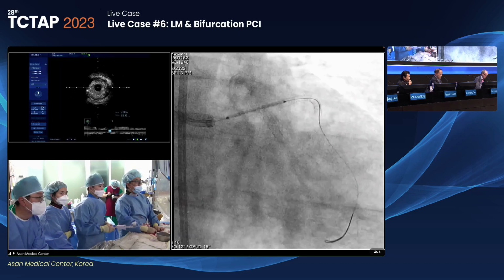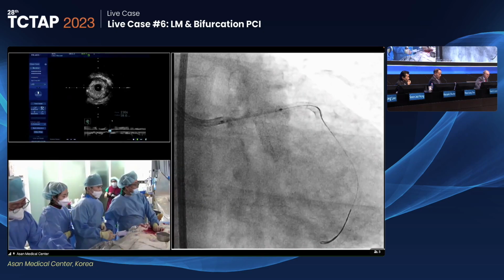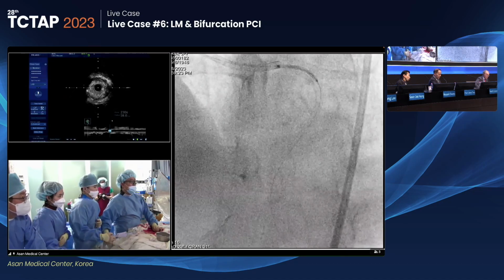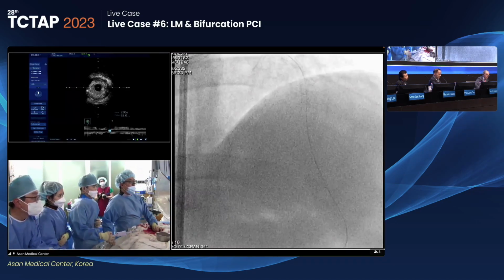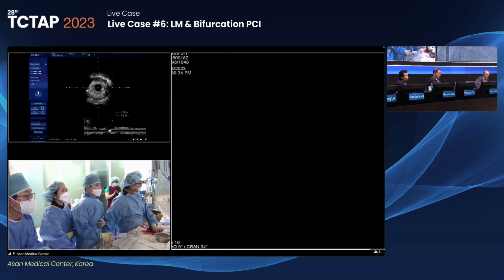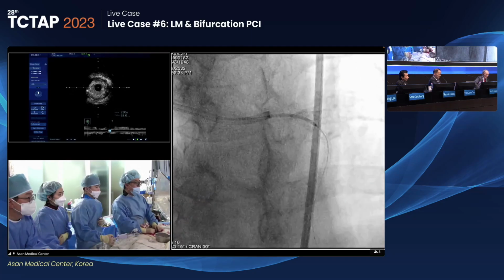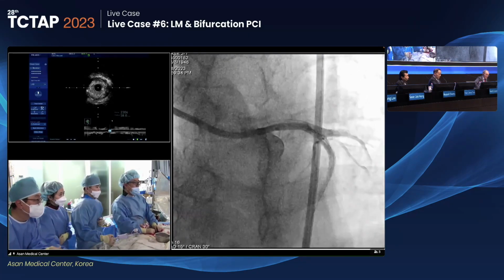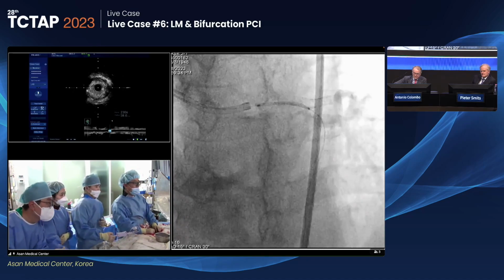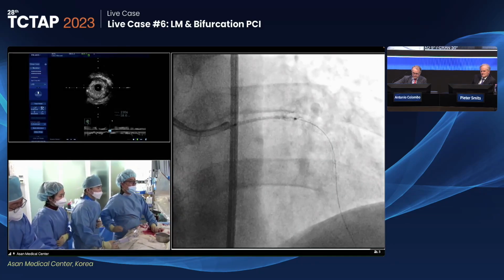What's the stent size? Okay. This is a 3.5? 3.5. Okay, the back is sufficient. Yeah, 2 millimeter overlap. Absolutely, good. This is stent booster, and it expanded well, and the left main ostium was just skipped. Okay, you can move back. Yeah, it does not cover the left main. Okay, good position, I think. Yeah, can you see this view well again?